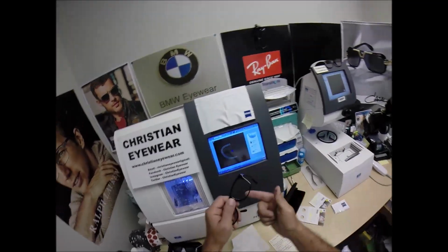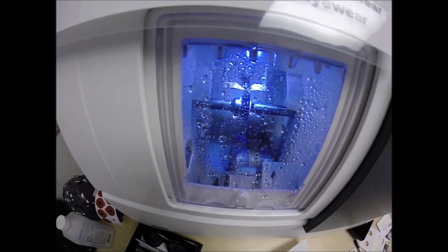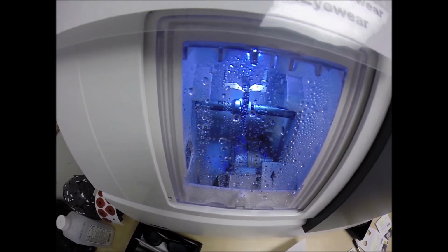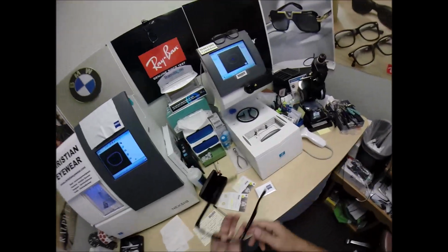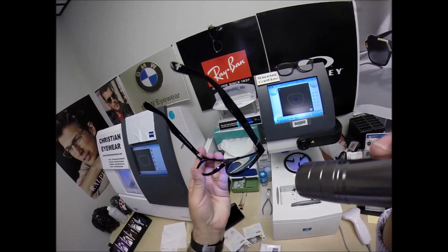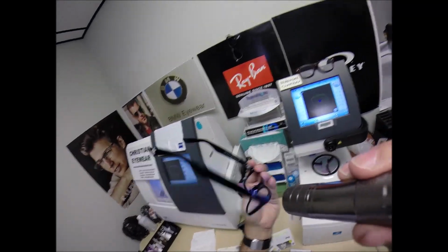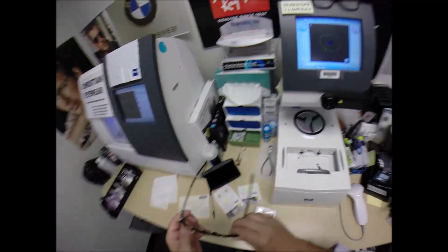And you can see it's tracing the shape of the left side of the frame. Just like before, measuring the thickness to know where to place the bevel so you have the least amount of edge thickness showing, of which for me, I have no edge thickness. That's why I use the thinner, lighter weight, unbreakable polycarbonate. And for the cosmetic reasons, for the safety reasons.